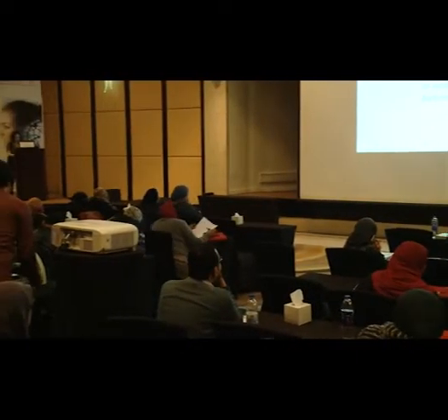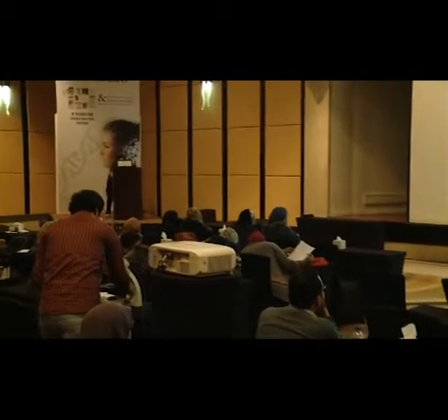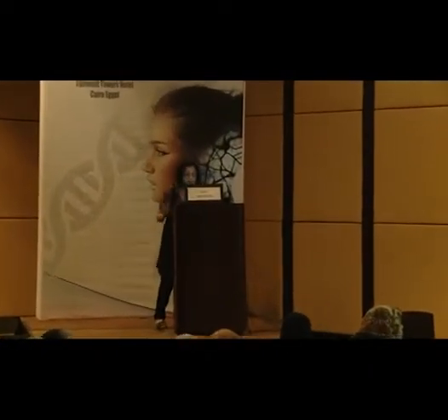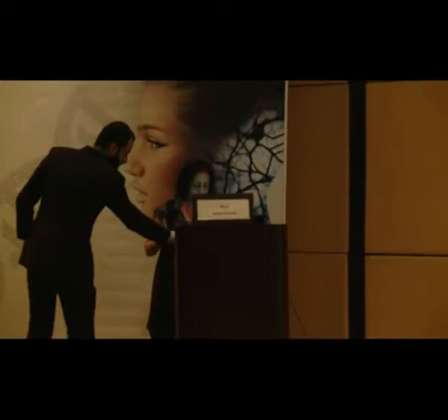So, without further ado, pointer. Okay, so the first case is a 69-year-old lady with a history of ovarian carcinoma. They imaged her and they found a solid and cystic mass in her vulva. And before they took her off to surgery, they said, we're going to take this mass out and see what on earth is going on with her.